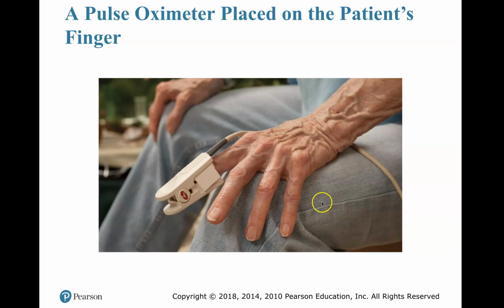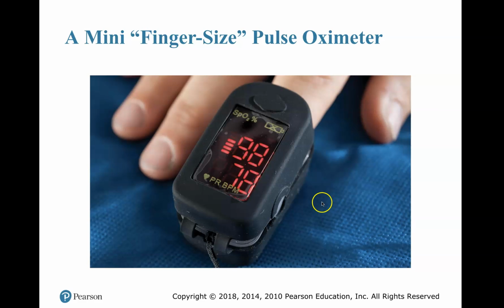That's what it looks like placed on a patient's finger. It's what you're probably going to see hooked to most of your monitors on the truck. There's the finger size one where it's just a little clamp and it's got a little screen on the top.